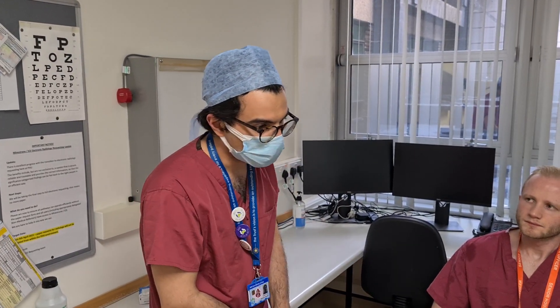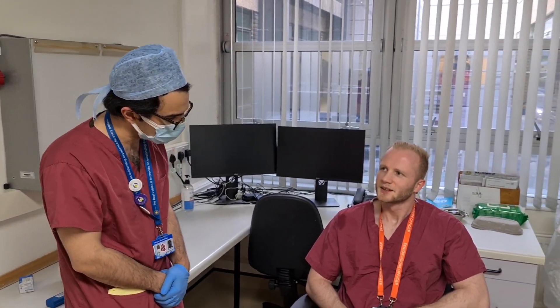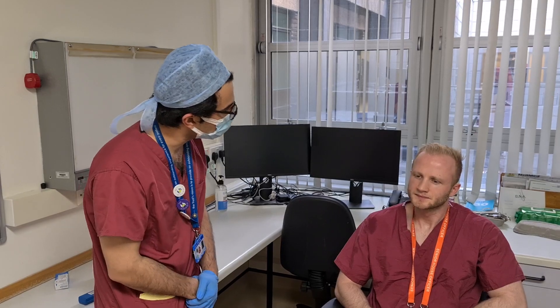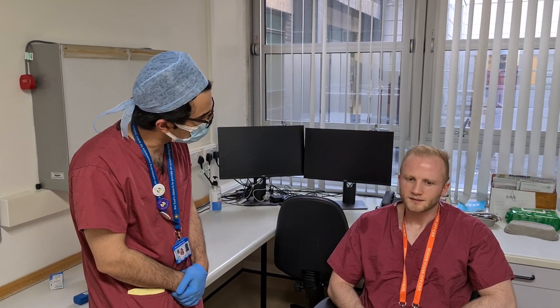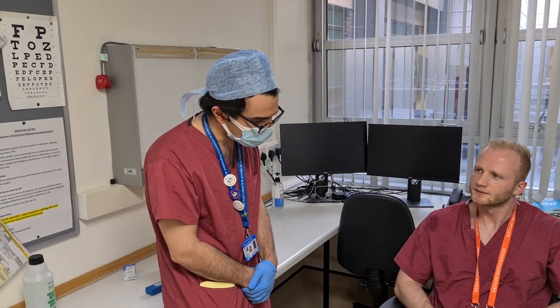I'm just going to introduce myself. Hi Dr. Ringrose, my name is Aria, I'm the ENT doctor. Thanks very much for coming. What we're going to do today is have a look at your vocal cords — your voice box — which generates sound and also acts as a gateway to your airway. Just to find out a little bit more about why you've been suffering with the symptoms that you have. Would that be alright with you? Great. Have you ever had this procedure before? I've not before. I'm going to take you step by step through what we're doing, and if you have any questions at any point, please do ask.